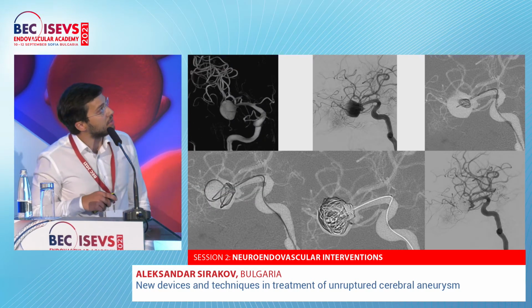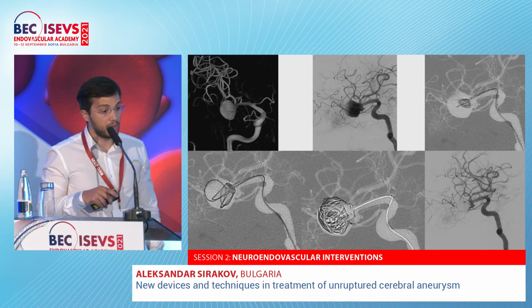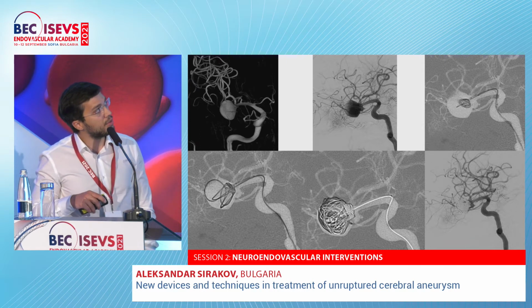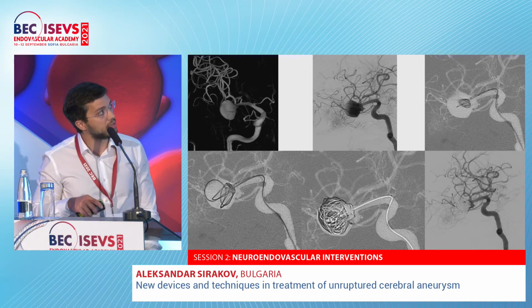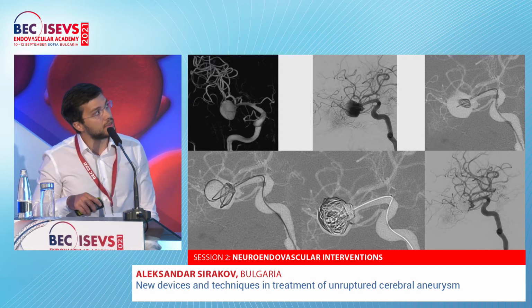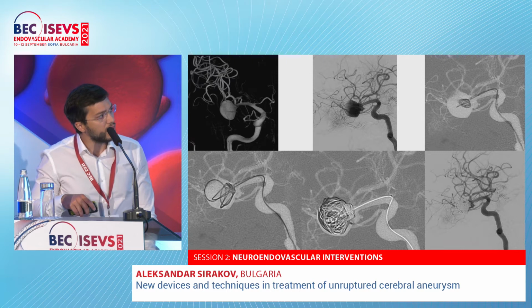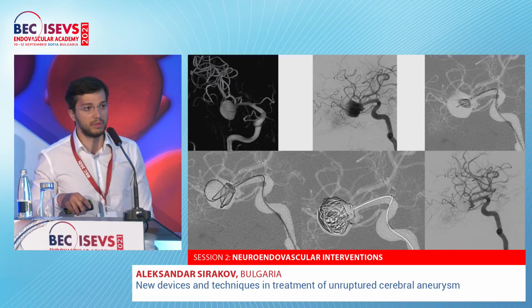That's a second example of Nautilus embolization, symptomatic MCA aneurysm. We evaluated the anatomy, and we decided that it's very crucial for the patient to protect the bifurcation of the MCA. This is what we exactly did. We deployed the Nautilus device inside the equatorial plane of the aneurysm, slowly retracted the device, navigated through the central pore with a second microcatheter, and started to insert coils slowly. This is the final angio, and it shows the complete patency of the MCA proximally and distally.